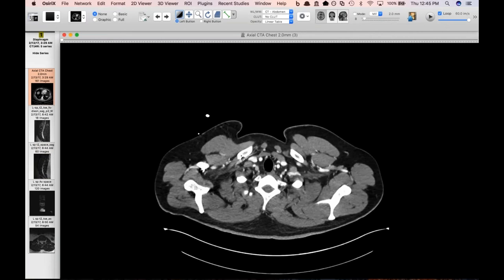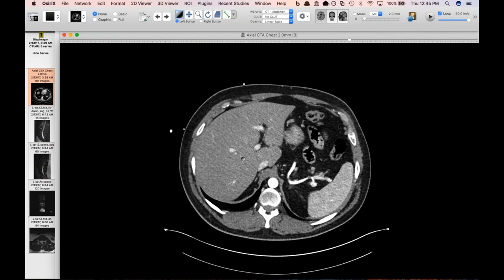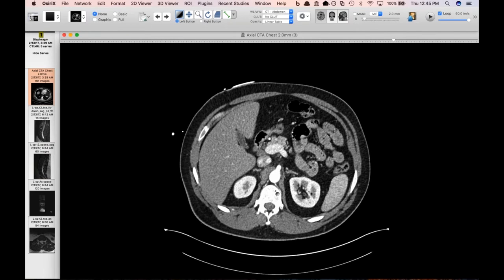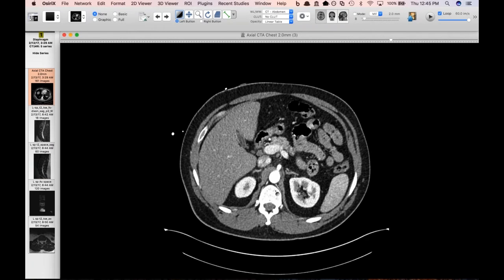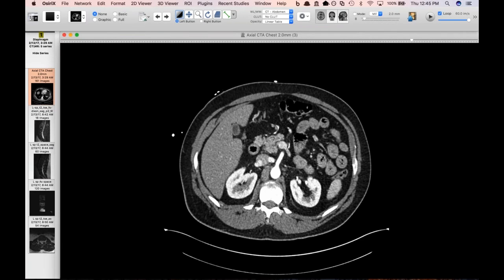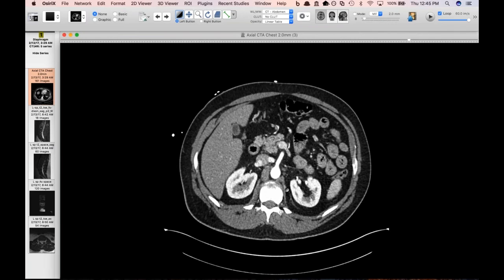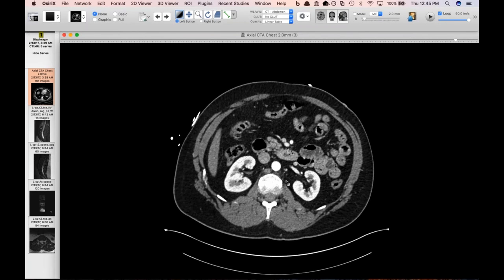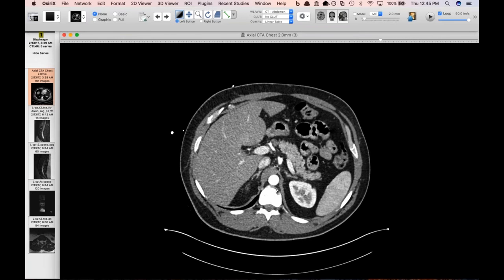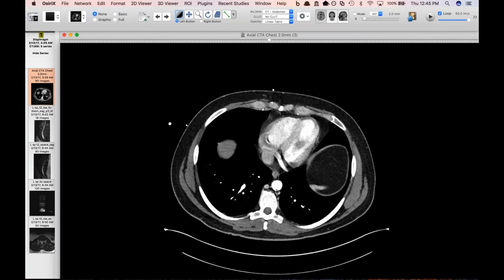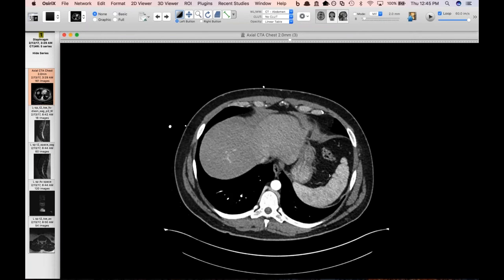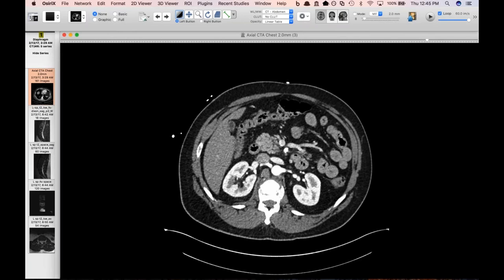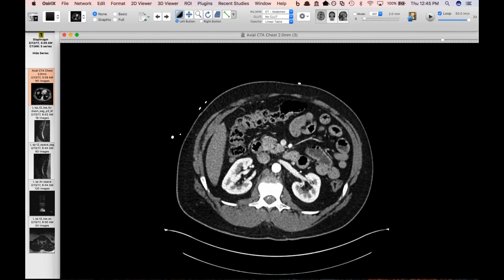I said it looked a little big, and I've never seen one this juicy, though I know they can be a little asymmetric. They ended up doing a spine MR — I think it's just asymmetric thickening, because there's absolutely no abnormal signal intensity within this crus on any of the sequences. Since she showed me this, I've seen a few cases where there is some asymmetry, with the right crus being larger than the left. The right crus usually is thicker than the left. This seems a little extreme, but probably just part of the range of normal.